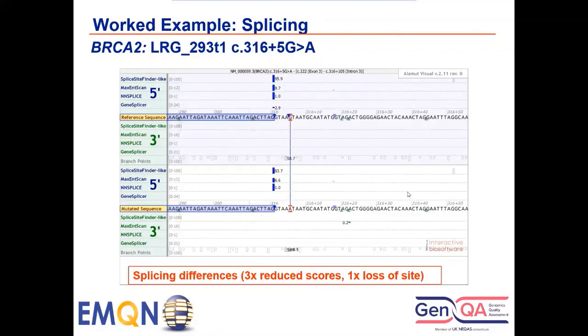And this is also seen in the different splicing prediction programs as here available through Alamut. And the predictions here are more subtle, except for GeneSplicer, which is completely lost for the splice donor site, while other prediction programs support a moderate decrease in strength. But there is, of course, now functional evidence that this variant indeed leads to an almost complete loss of exon 3.